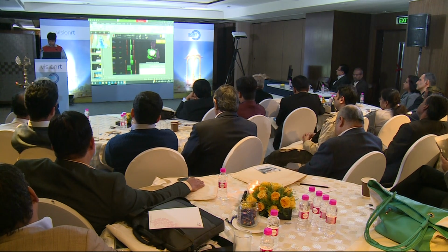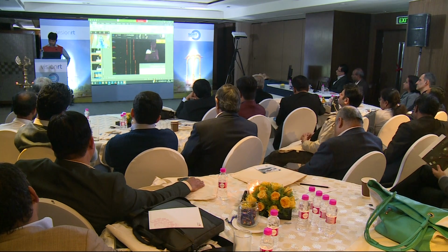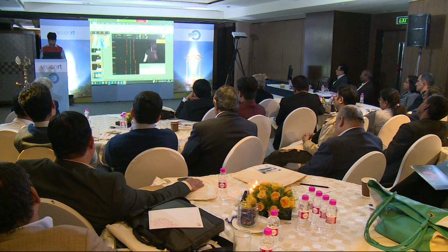So if you move to slide 29, next slide, you can put an ROI in the shoulder. After you get gross positioning with the large ROI, you can then go in and move the shoulder to the right position. This is all happening in real time without leaving the room. Next slide, on slide 30, you can then turn on an ROI on the arm.